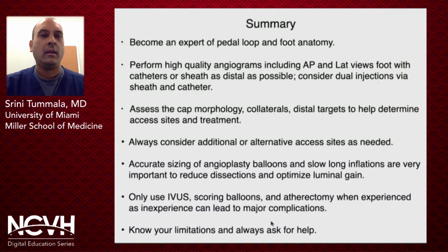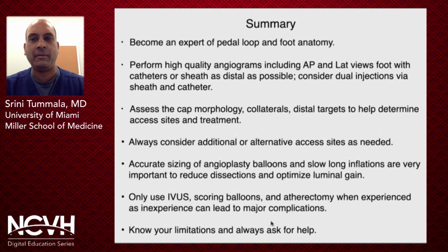So in summary, become an expert of pedal loop and foot anatomy. That is the key to a lot of these interventions. Perform high-quality angiograms, including AP and lateral views of the foot, with catheters or sheaths as distal as possible, and consider dual injections via the sheath and maybe via a catheter that's in one of the tibial vessels to really optimize the visualization of caps and collaterals and distal targets, because this will help to really determine your access sites and treatment.